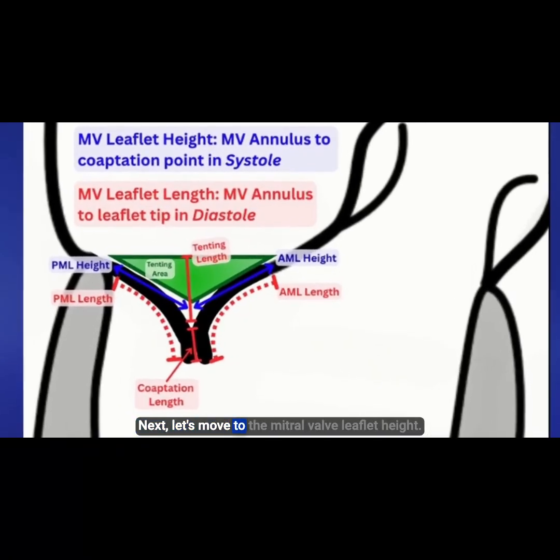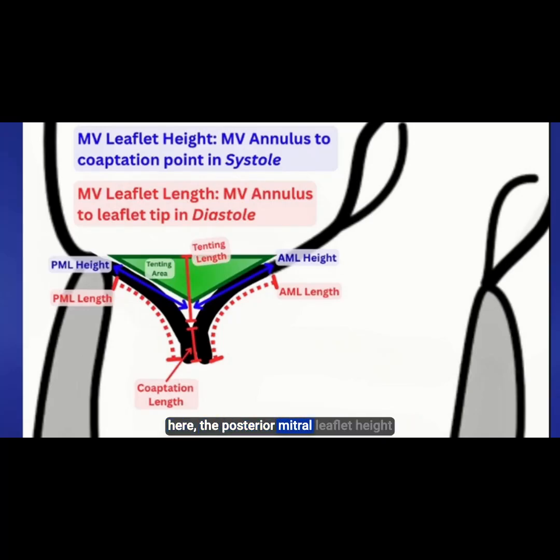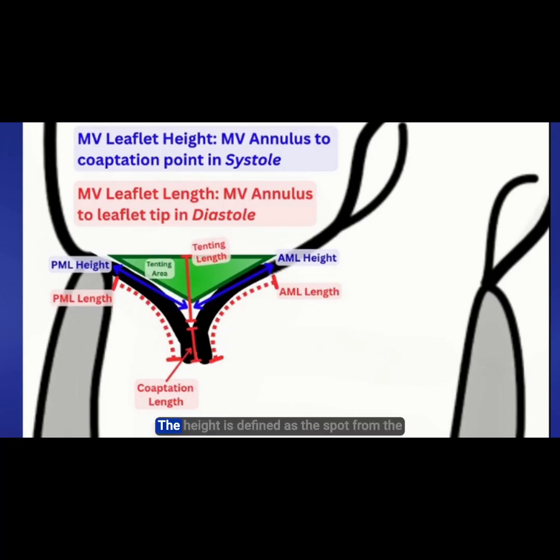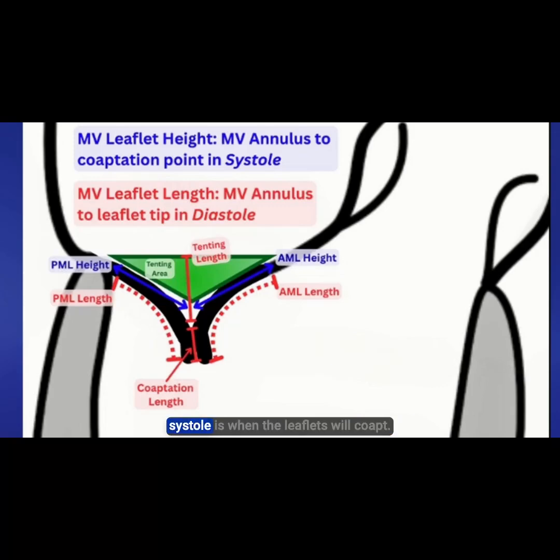Next, let's move to the mitral valve leaflet height. You'll see with the blue arrows here the posterior mitral leaflet height and the anterior mitral leaflet height, and this height is always going to be shorter than the length. The height is defined as the distance from the mitral valve annulus to the coaptation point in systole, and it's measured in systole because systole is when the leaflets will coapt.